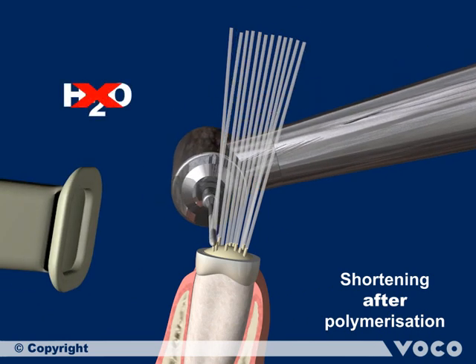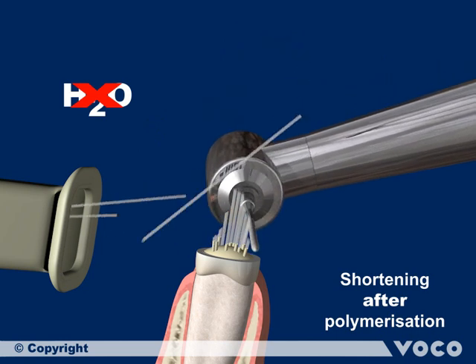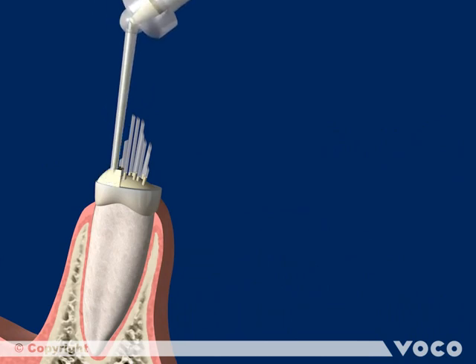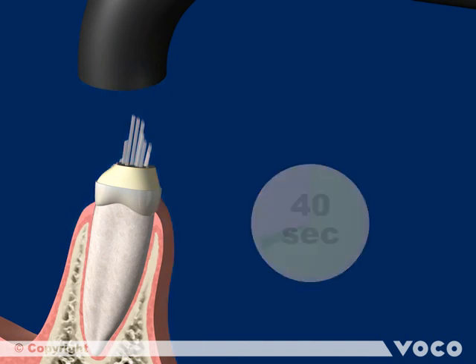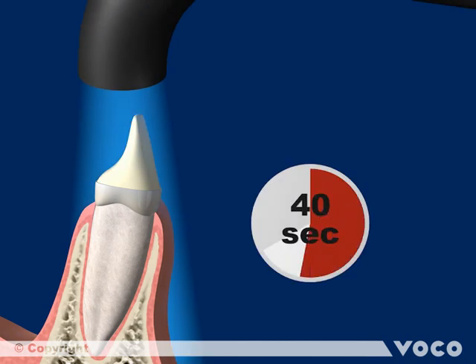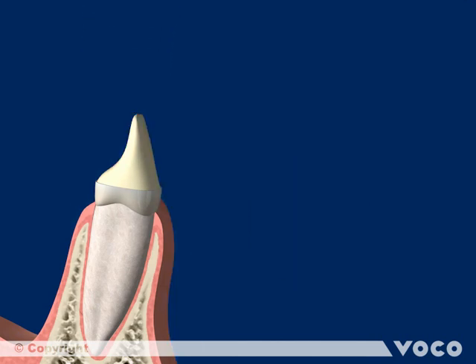Cut the single posts with a suitable diamond burr at high speed without water cooling but with suction. The core build-up can now be completed. Apply and light cure Rebuilder DC either in layers or build it up completely. Set the material with 40 seconds of light curing, then wait for the chemical curing to take place for another 5 minutes.